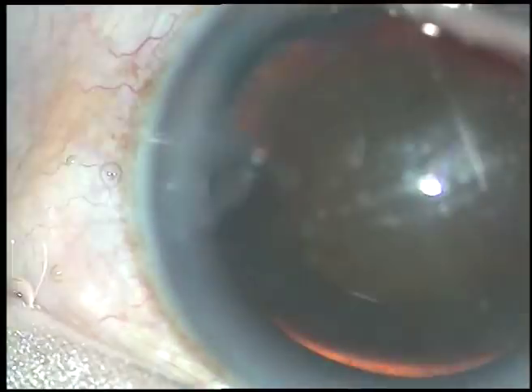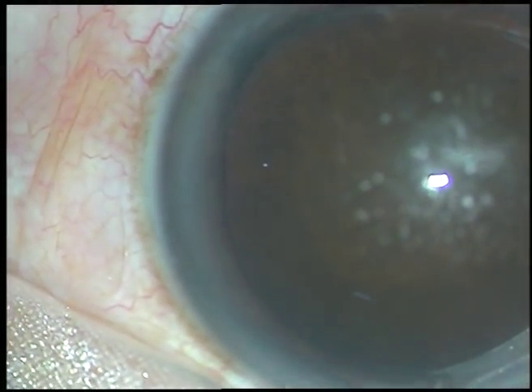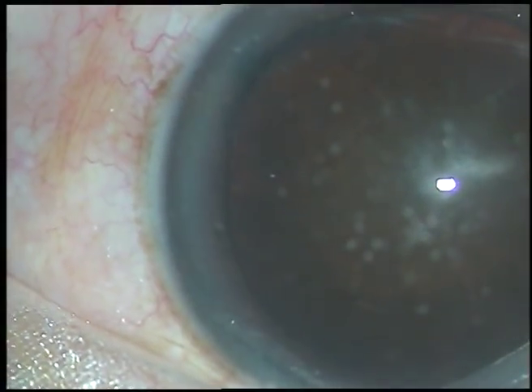Apply a few drops of povidone iodine 5% and then thoroughly irrigate the ocular surface with Ringer's lactate or balanced salt solution.